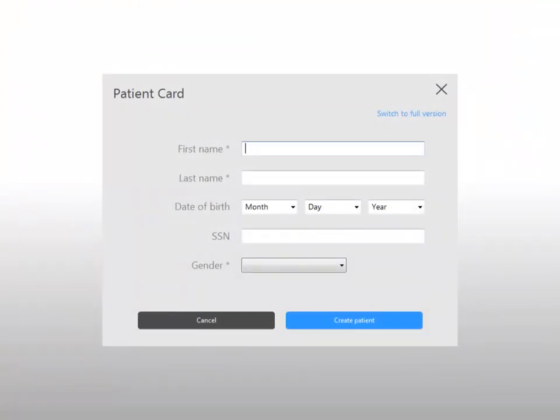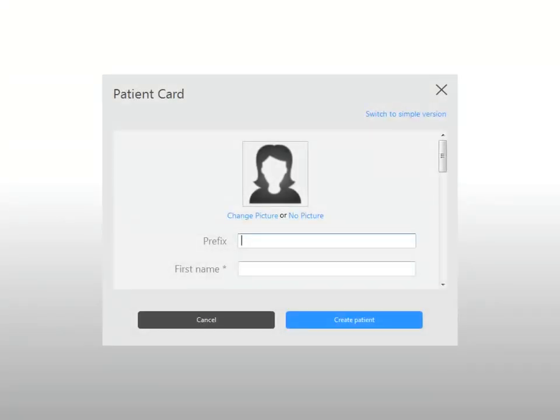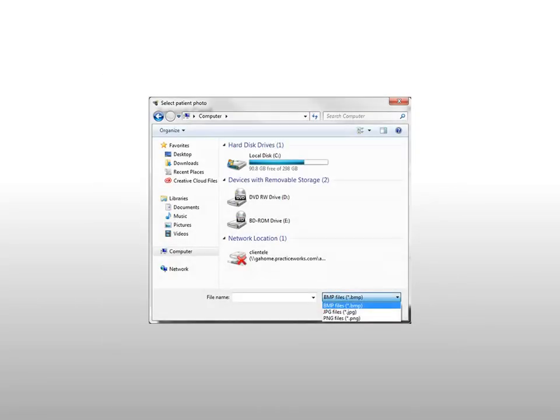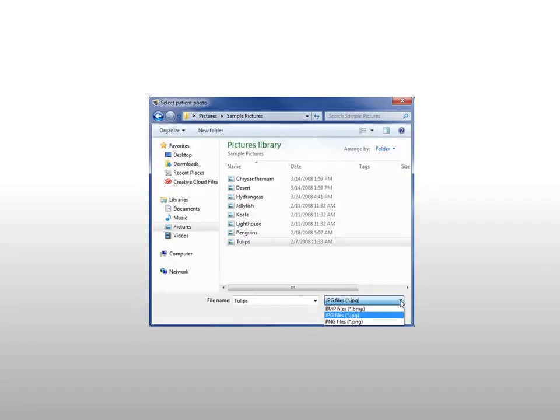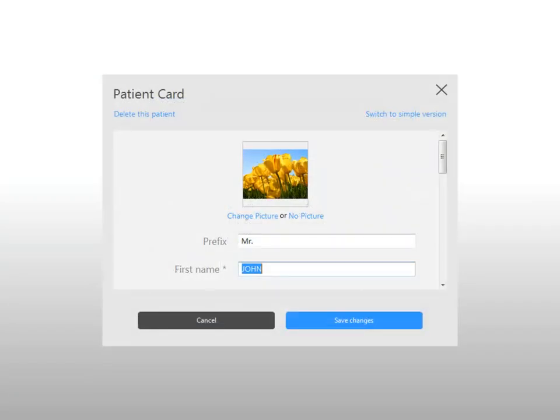To add a picture to a patient card, click Switch to Full Version. The patient card window expands to display additional fields. Scroll to the top of the patient card window and click Change Picture. The Select Patient Photo window is displayed. Use it to locate the picture file. Click the File drop-down list alongside the File Name field to select a different file type. When you have found the correct picture file, click to select it, then click Open. The selected picture file is added to the patient card.